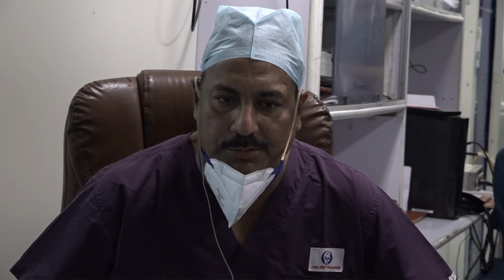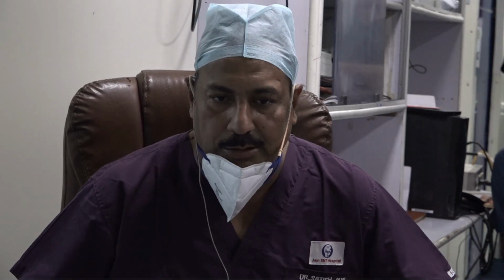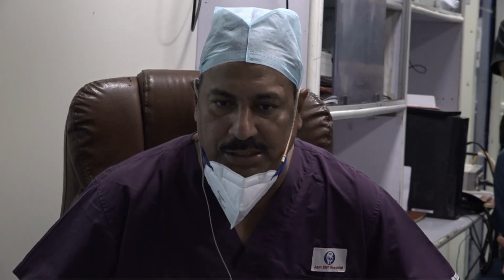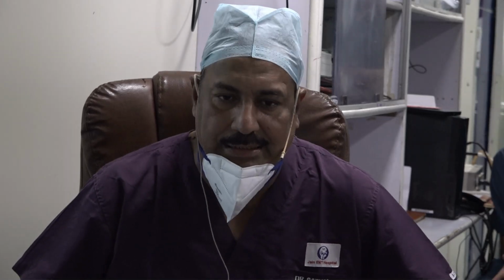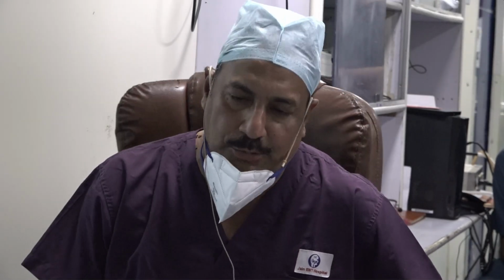So our technique, what we propose, is looking at the entire middle ear cleft. We need to look at the eustachian tube, we need to look at the mesotympanum. I will address that surgically and discuss. And the mastoid air cell system, which is dependent upon the aeration down the eustachian tube.